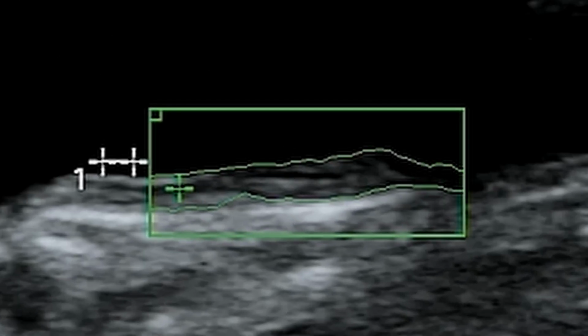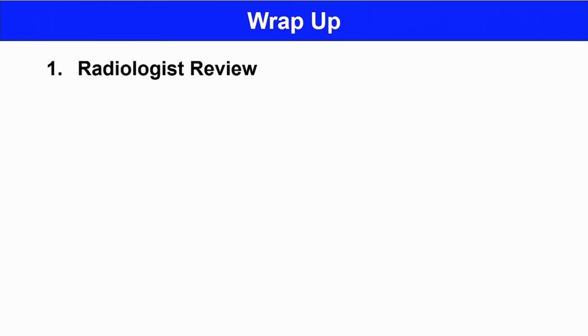We definitely see some widening here and heterogeneous plaque that's well on its way to being calcified. That's a good thing. And that's it. We're done. This all gets compiled and sent to radiology for interpretation and analysis, and in a few days you get a final report, which is usually just a page or two of numbers.